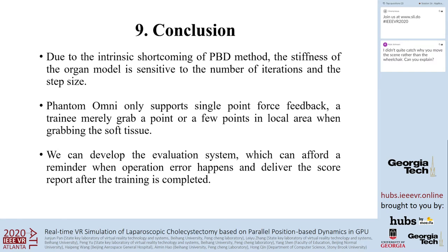Nevertheless, there are certain limitations in our simulation. Due to the intrinsic shortcoming of the PBD method, the stiffness of the organ model is sensitive to the number of iterations and the step size. But it could be eliminated with extended position-based dynamics, XPBD, which can be employed in our simulator in the near future. At present, Phantom Omni only supports single-point force feedback.